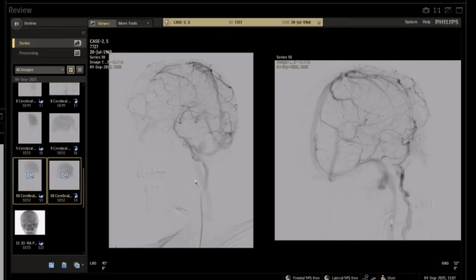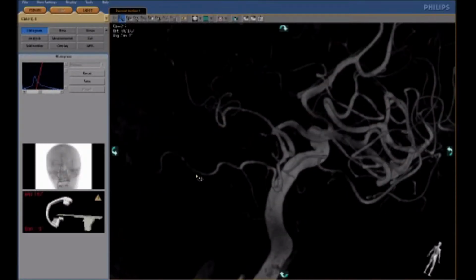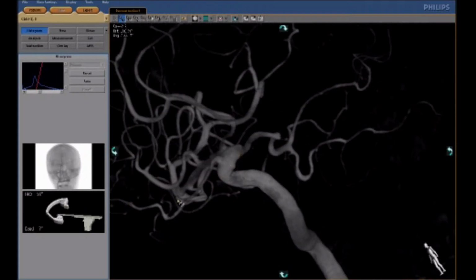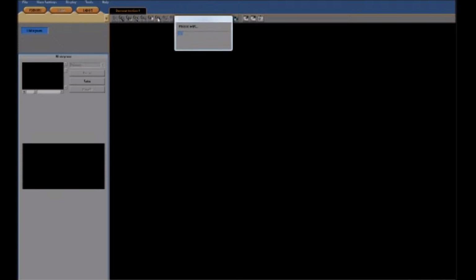First of all, I would like to check the right side. Just a second. Right side, and then we will check the left side. For me, the important side is the left side. The right side looks like just the beginning of the aneurysm. It's an irregularity, and we can follow this aneurysm. Maybe it's just an irregular ICA. Let's count it as an irregular ICA. And there is more aneurysm on the left side.